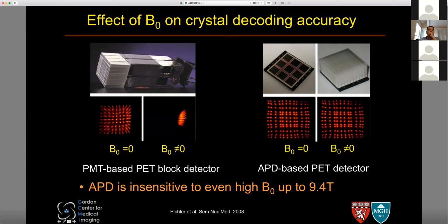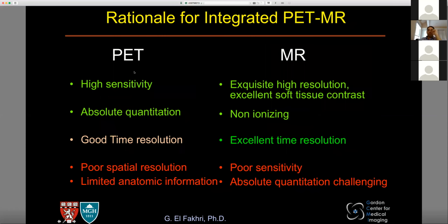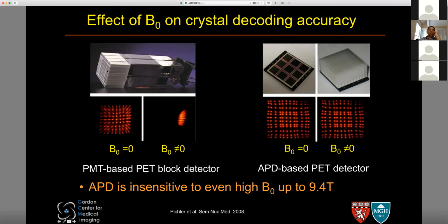So you need to have a solid state detector here that is going to allow you to detect those photons and then amplify them without ever having electrons in vacuum, with electrons in solid directly being detected. And that's what the solid state detector does. That's what the avalanche photodiode does. One thing I'd like to draw your attention to is the aspect ratio. This crystal is the same as this crystal. So this is 2 centimeters. This is 2 centimeters.